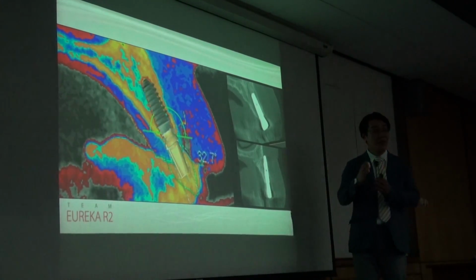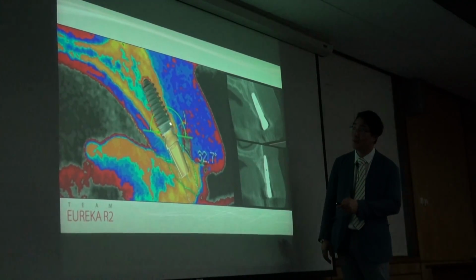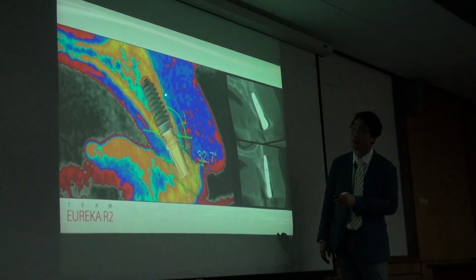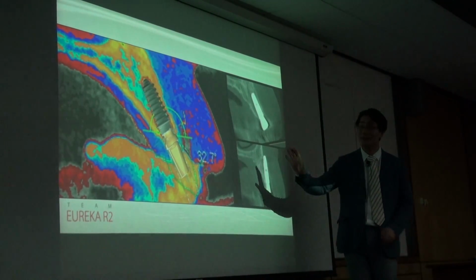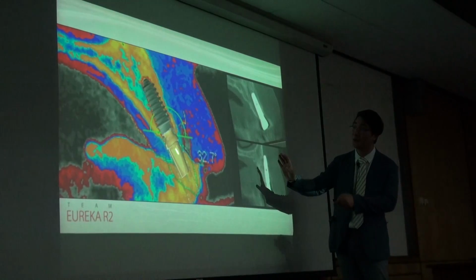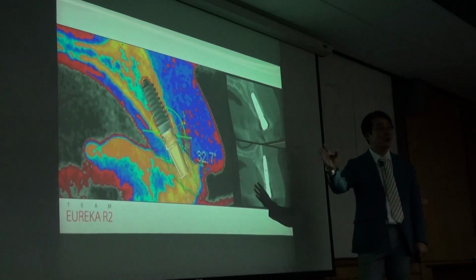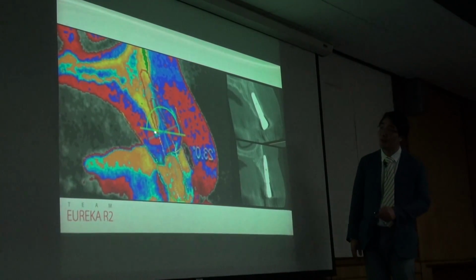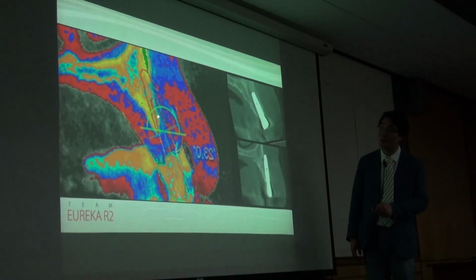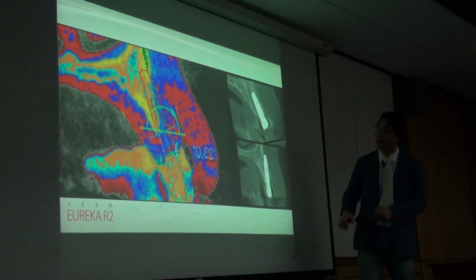Yes, as Professor mentioned before, after preparation of the bone, in healed ridge side, especially the buccal and the lingual bone is very hard. In this time, after preparation, when you put in an implant, there is no mismatching in virtual and real status. But in this kind of severe resorption case or extraction socket case, can you see this?